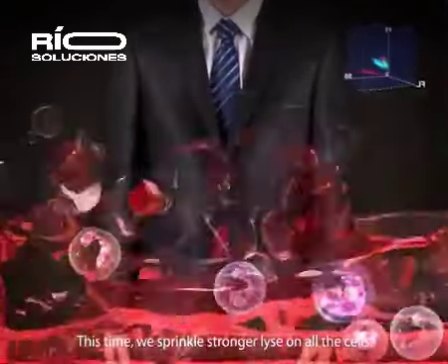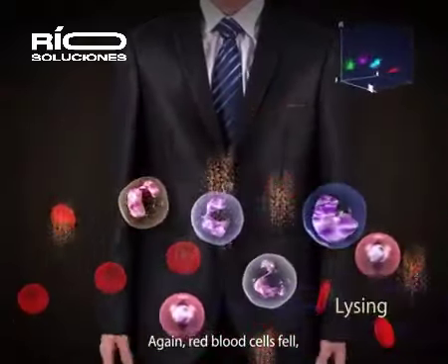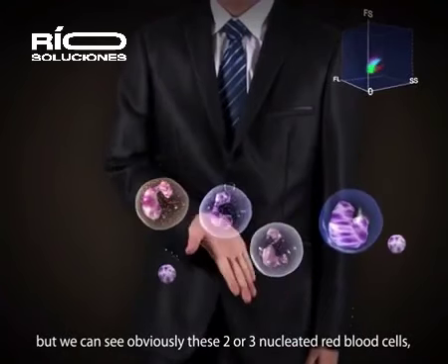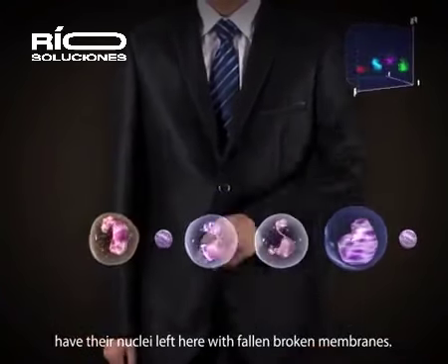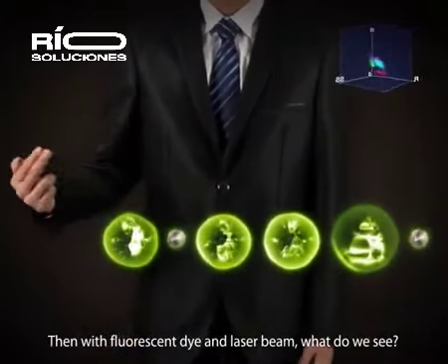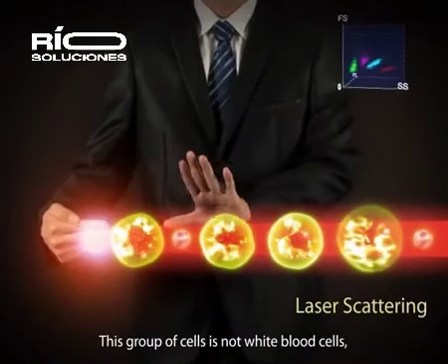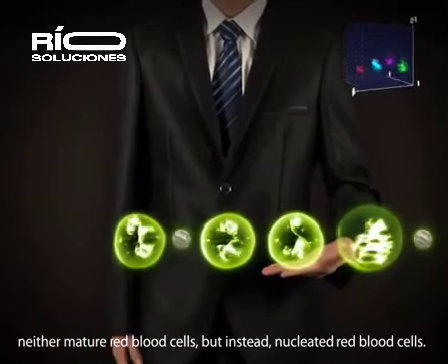This time, we sprinkle stronger lyse on all the cells. Again, red blood cells fell. But we can see obviously these 2 or 3 nucleated red blood cells have their nuclei left here with fallen broken membranes. Then, with fluorescent dye and the laser beam, what do we see? This group of cells is not white blood cells, neither mature red blood cells, but instead nucleated red blood cells.